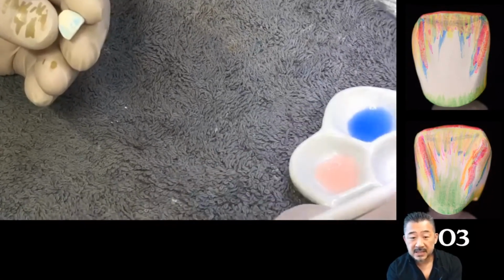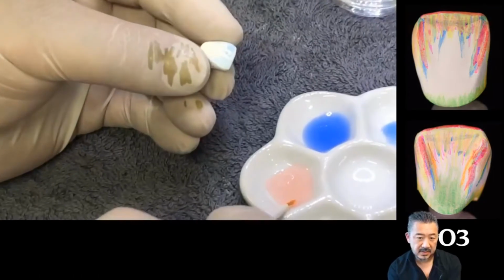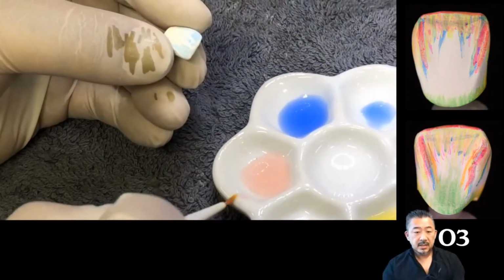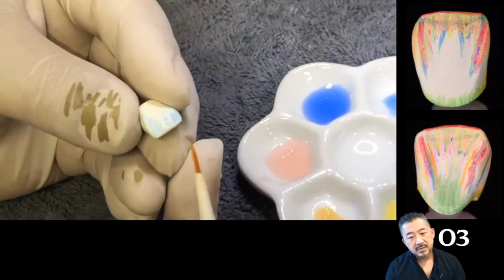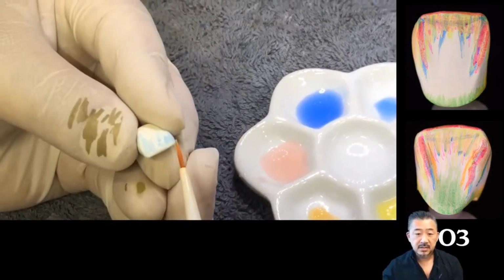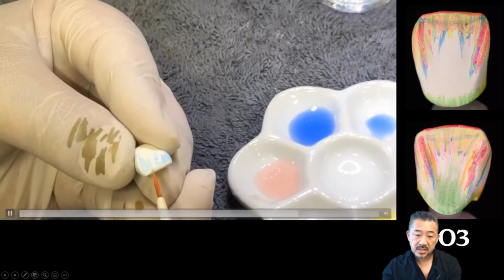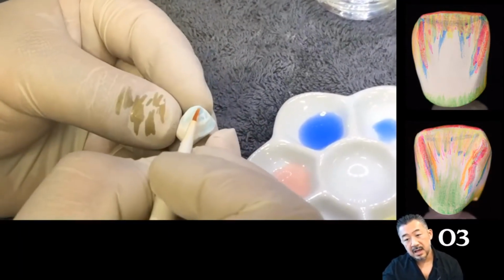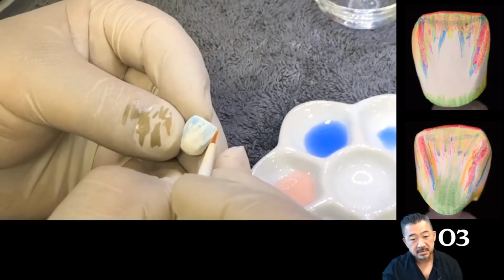Well, anyway, that's all the steps. So this step is completed. This means if you want to use the TT multi-layer disc, you just need to use O1 orange, O2 brown, and optionally O3 vanilla.